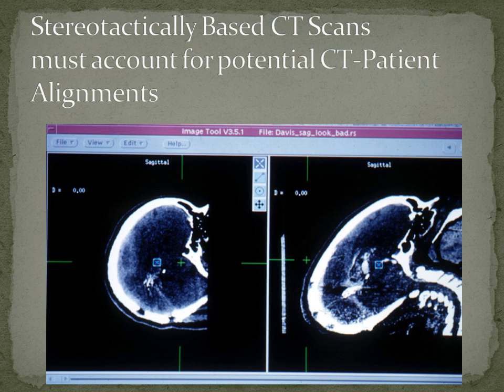And so the first thing we do when we process an image is we look at the image, we check to see, does the DICOM header on the image tell us that the scanner is straight? And then we do a calculation to say, is what the DICOM is telling us true? And after it passes those two tests, we then go ahead and do the rest of the reconstruction. If it doesn't pass those tests, we have mathematical methods of actually fixing that.